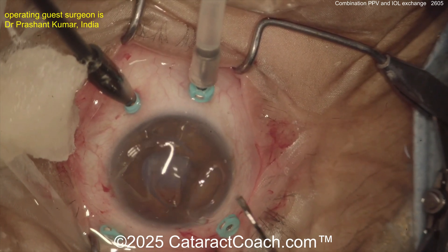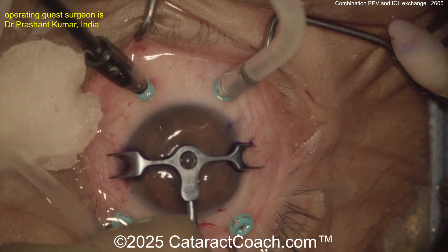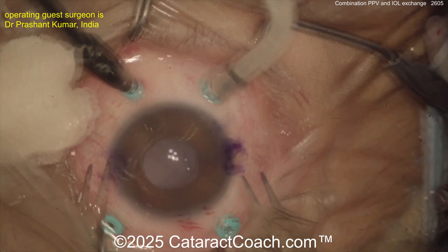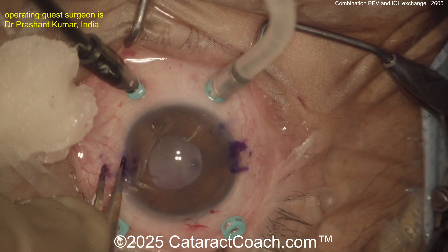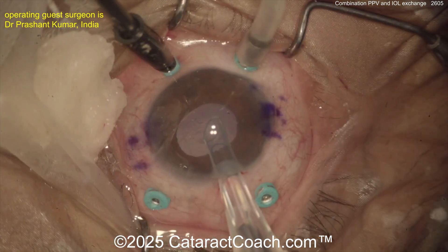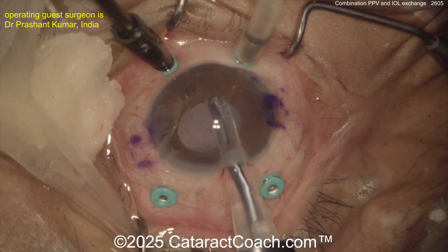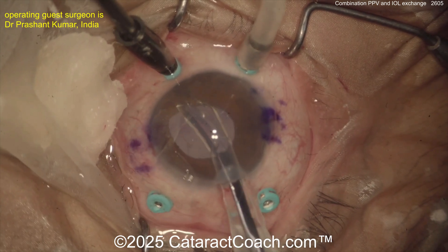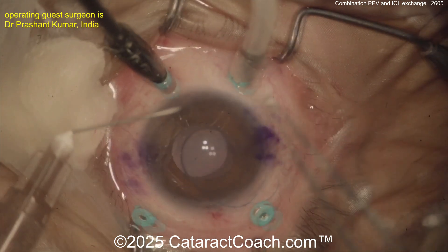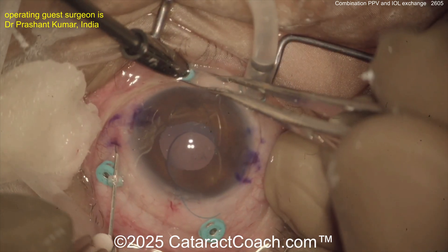The residual vitreous may also affect the tilt of the lens, and any tilting and chafing of the iris can result in post-operative CME. Everything looks cleaned up, so it's going to mark for Yamane placement. I typically use a 30-gauge TSK thin-wall needle — looks like here it's going to be a larger needle, but that gives you the best fixation of the haptic. If you don't have a thin-wall 30-gauge needle, a regular 30-gauge won't do, but you can use a 27-gauge as an alternative. I like this method of putting the whole IOL on top of the iris first — it gives stability, and when you get the needle in it's a lot easier to thread that haptic.